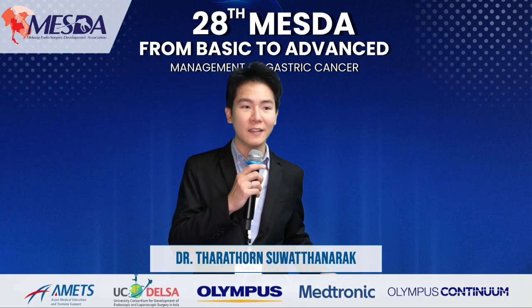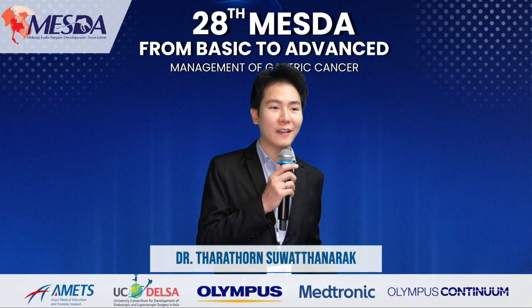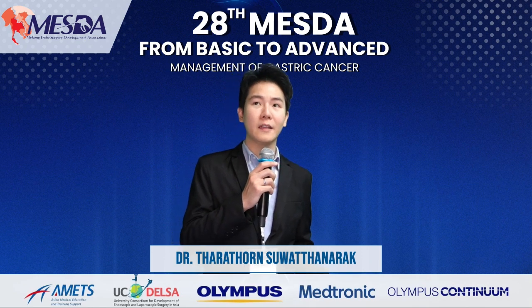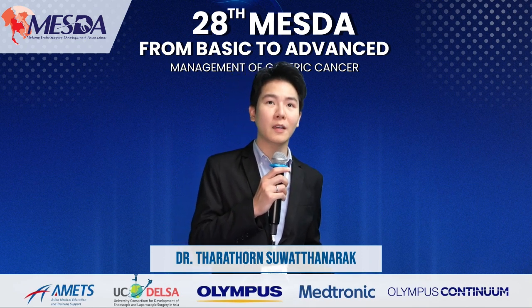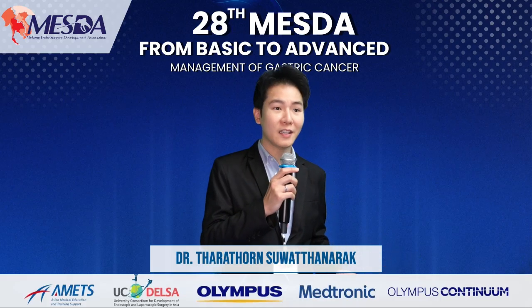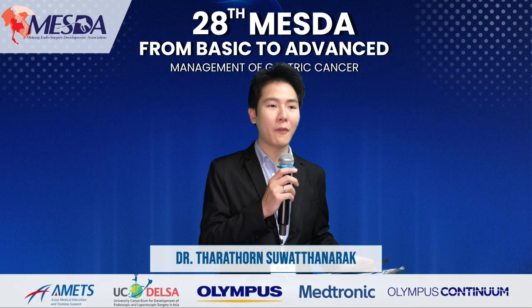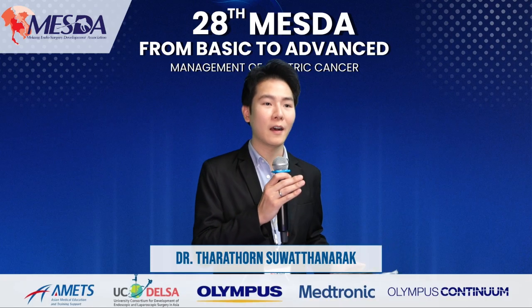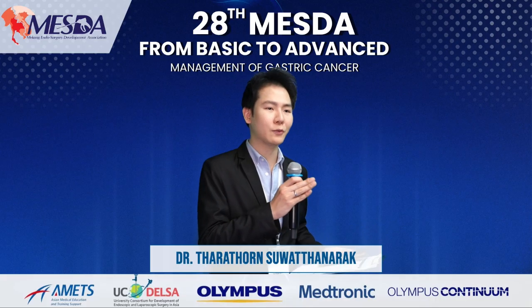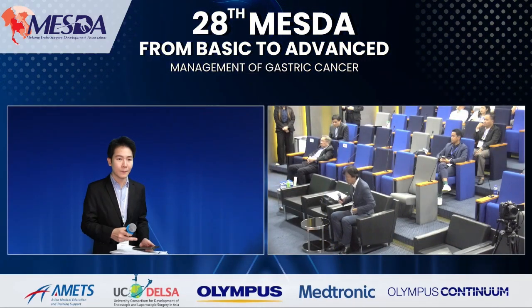I have some question about the robotic gastrectomy, Professor Etoh. About distal gastrectomy or proximal gastrectomy, the origin of dissection, do you decide to perform which area first? What is the difference between distal gastrectomy and proximal gastrectomy in robotic surgery?